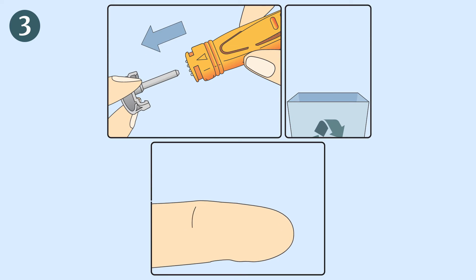Clean the end of the middle finger or ring finger with cotton dampened with alcohol. Rub the chosen finger towards the tip for 10 to 15 seconds to enhance the blood flow.